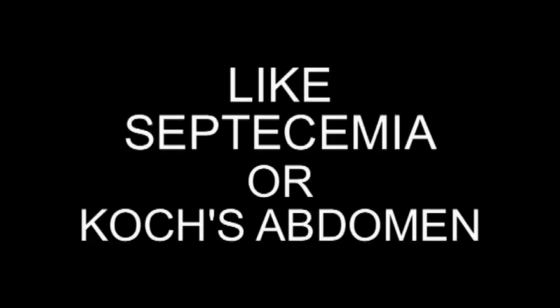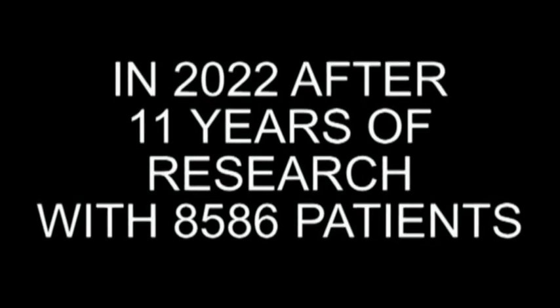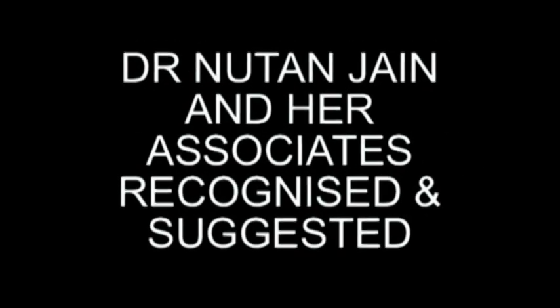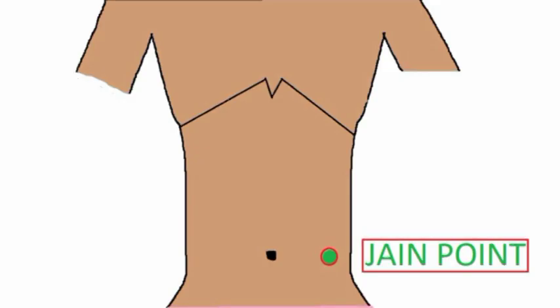Koch's abdomen. Then in 2022, after 11 years of research with 8,586 patients with one previous surgery or more than one surgery, Dr. Nutan Jain and her associates recognized and suggested a new non-umbilical entry point for laparoscopic surgeons. We will discuss this very substantial study in some detail in this short documentary. But first let us see where this point is situated, which is now known as Jain point.